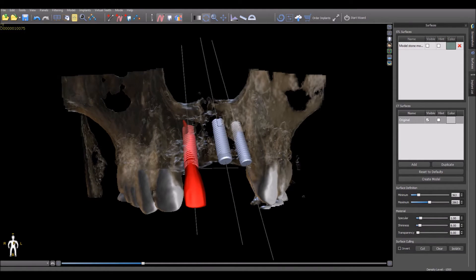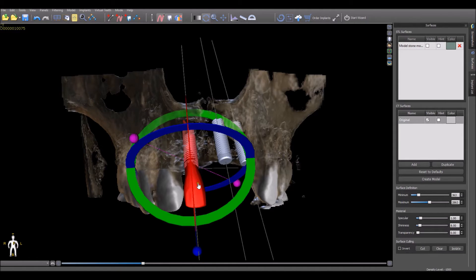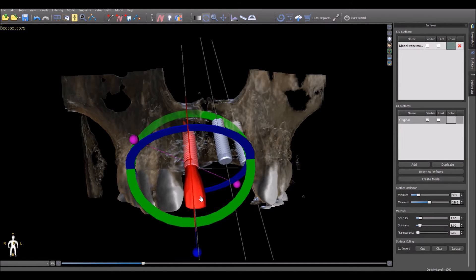The same functionality works for a virtual tooth. Simply click on the virtual tooth and then use the arrows on the keyboard to move the virtual tooth in any direction. To rotate, hold down the Alt key and use the right or left arrows to rotate the tooth mesial-distal, or the up-down arrows to rotate the tooth buccal or lingual.